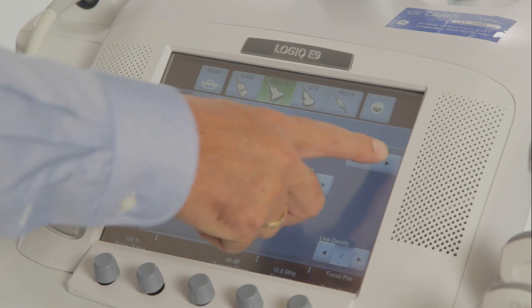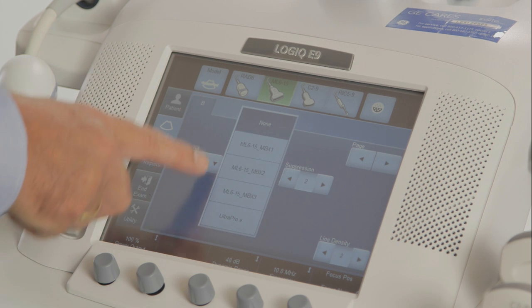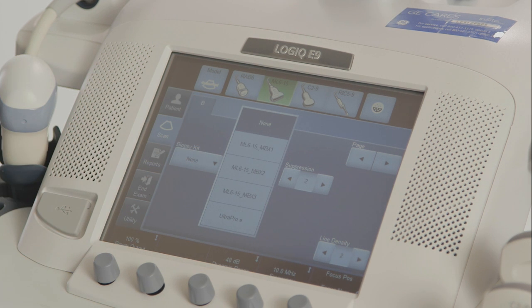Consider using a biopsy guide, which is found on page 2 of your B-Mode tab, as this will help keep the needle in the imaging plane.